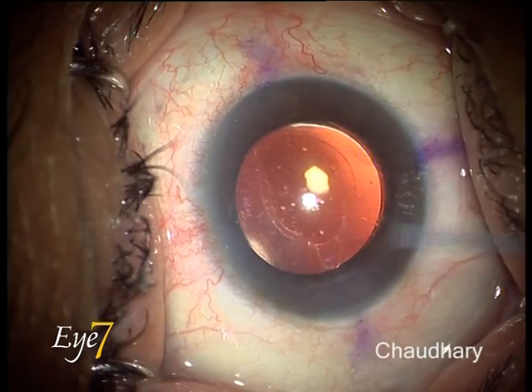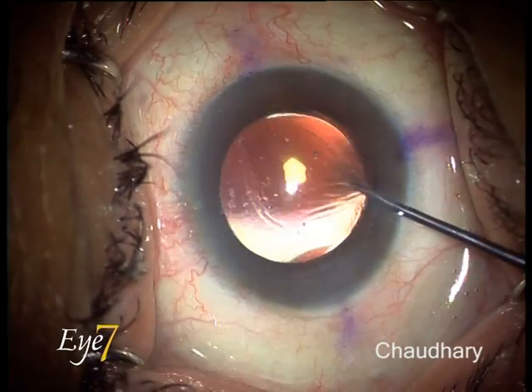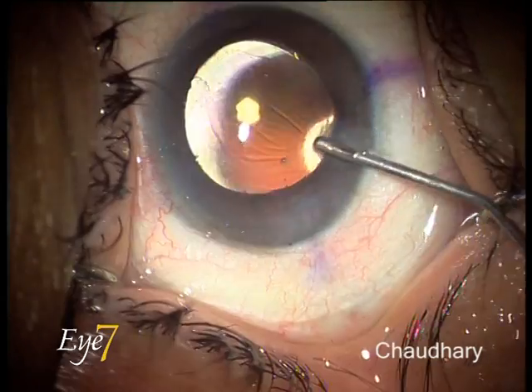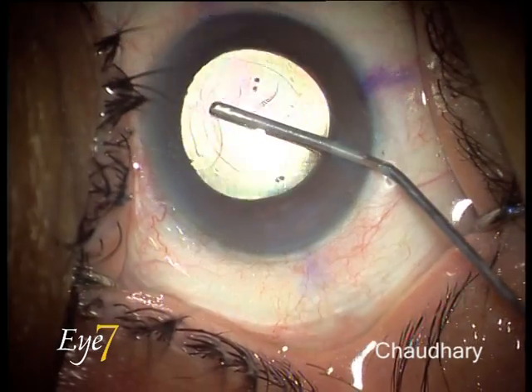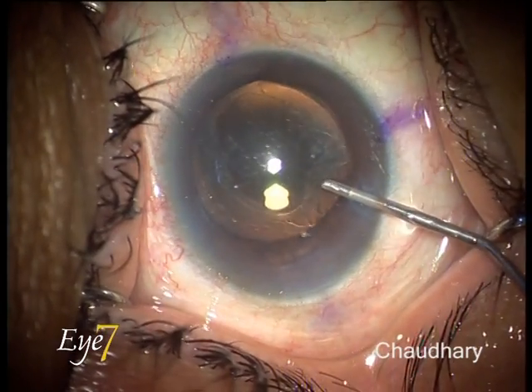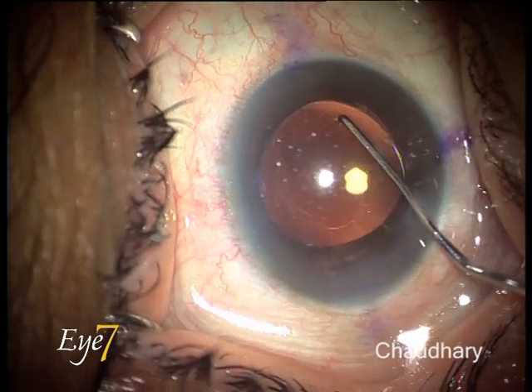The dilemmas before the surgeon: After 15 days, would the capsular bag adhere to the lens, preventing smooth dialing? Could a forced dialing lead to a zonular dehiscence or a capsular bag tear? What are the ways to ensure a problem-free dialing?